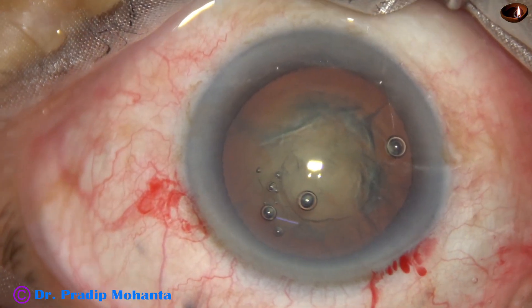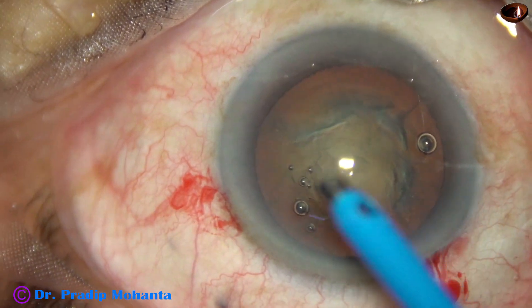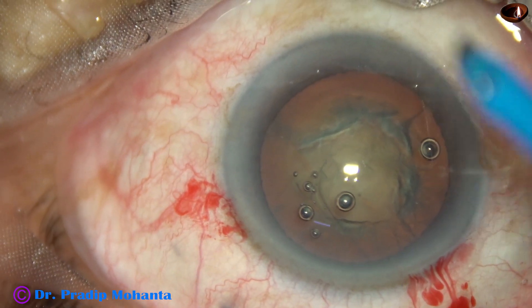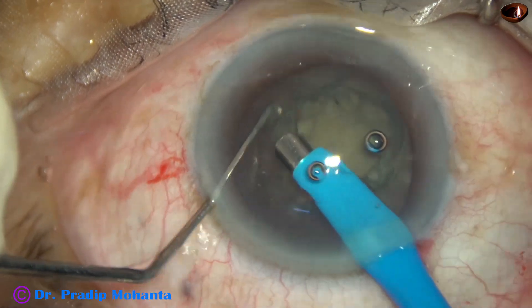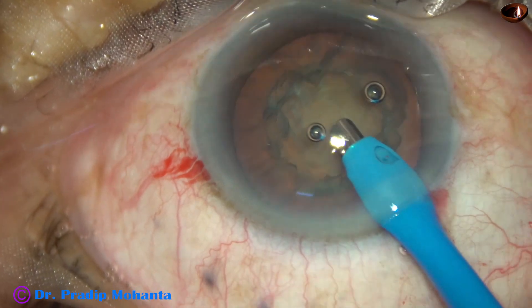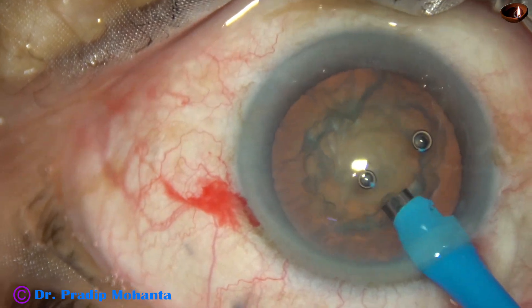The anterior chamber is again filled up with viscoelastic. Now it is time to go into the anterior chamber with the phaco handpiece. The phaco needle goes in with its bevel down. Some superficial cortical lens matter is removed. At this time I am at high vacuum — 450 vacuum and 45 flow rate. Ultrasonic energy is set at 70%.